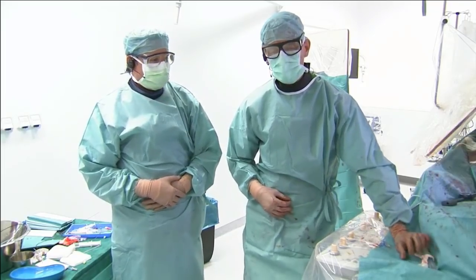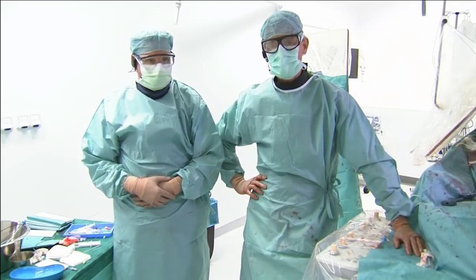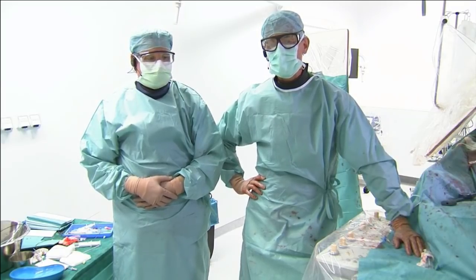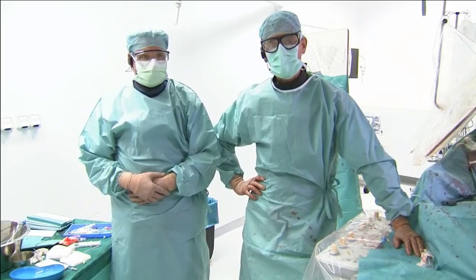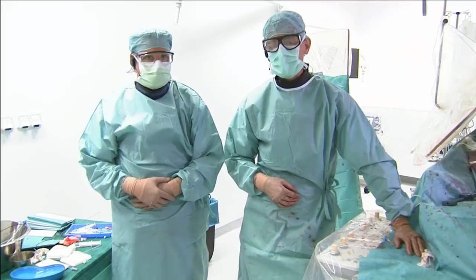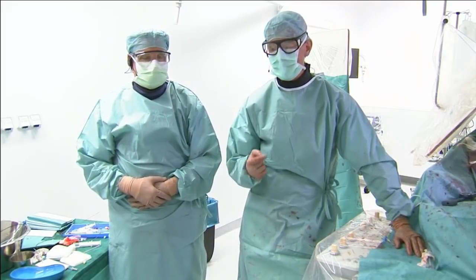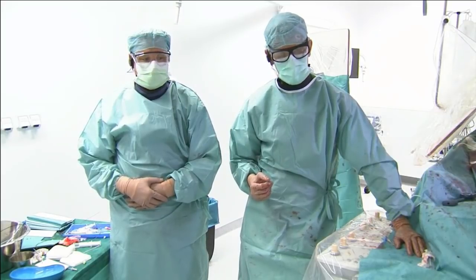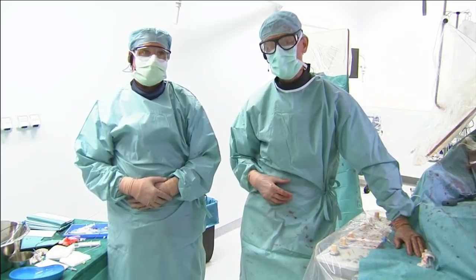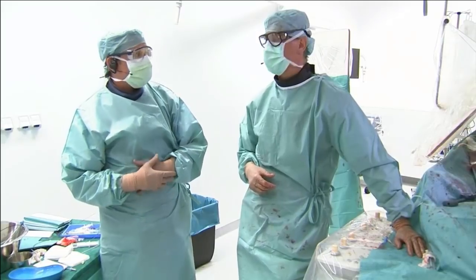Maybe you allowed us to do whatever we found interesting, and therefore we chose some very complex cases with which we want to show some of our techniques, which I think are very helpful, and really difficult lesions. So we have here one SFA which is extremely calcified, and then comes a case which is really complex. We'll show you later, and if we have time, another below-the-knee artery. But maybe first of all, Sven, maybe you can introduce the first case.